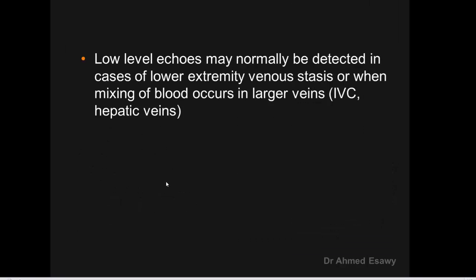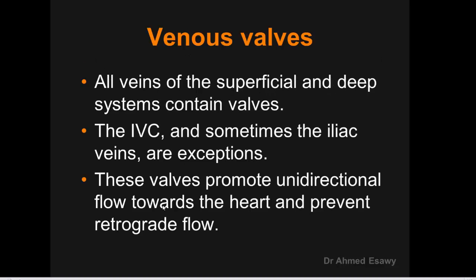Low-level echoes may sometimes be normally detected in cases of lower extremity venous stasis or when mixing of blood occurs in larger veins such as the IVC and hepatic vein. Low-level echoes do not mean DVT; they may be seen normally in lower extremity venous stasis.